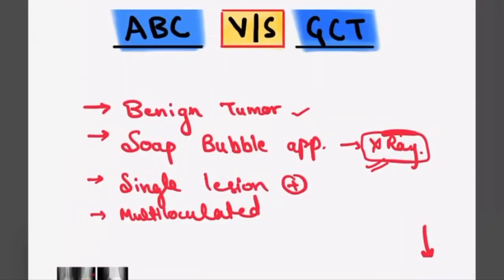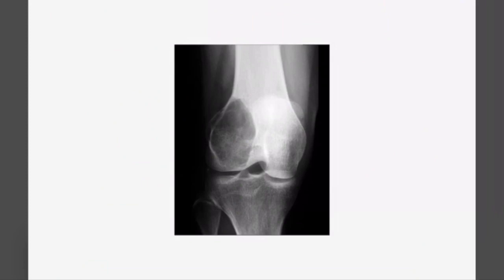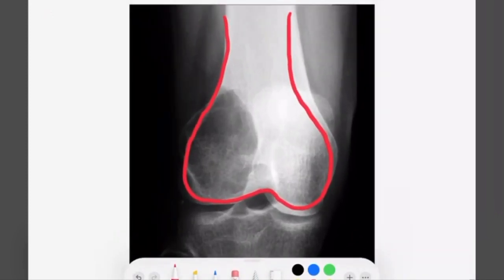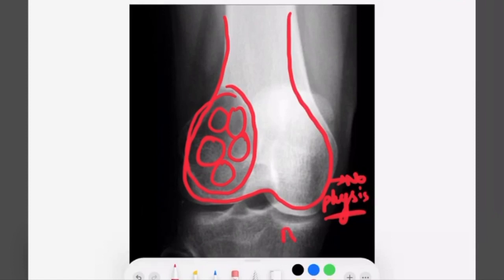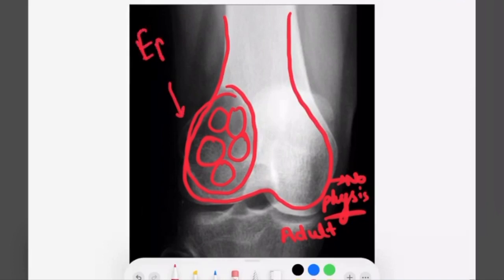Coming to another X-ray — this is also an X-ray of the knee and we can see the femur and a lesion. There is multi-loculation showing soap bubble appearance, and there is no physis. No physis means the patient is an adult and bone maturity has been developed. The site of this lesion is in the epiphysis — it is epiphyseal.